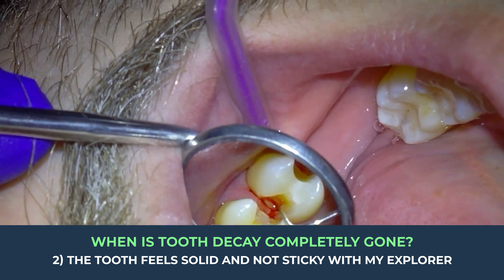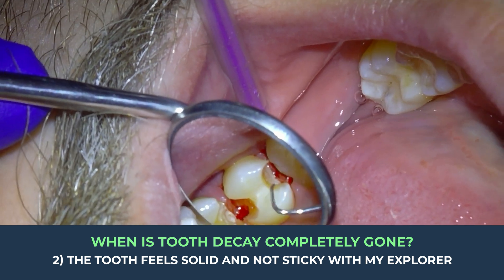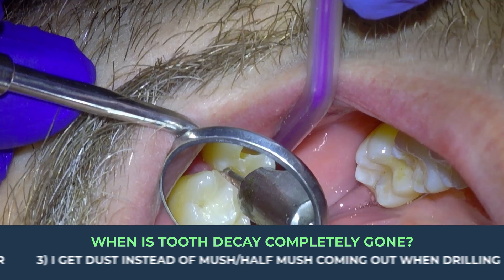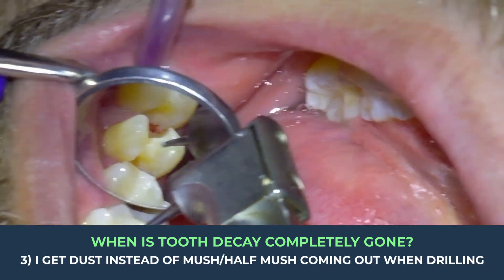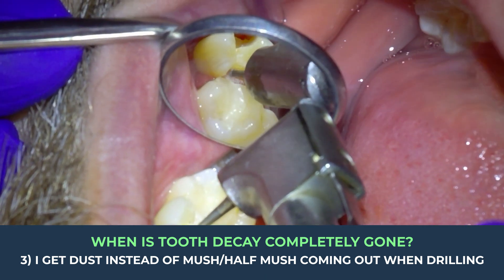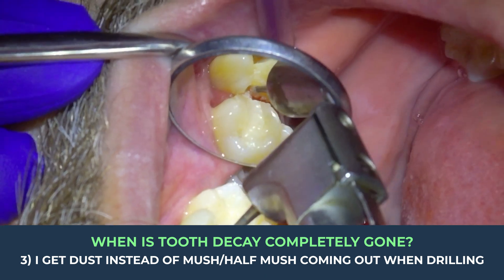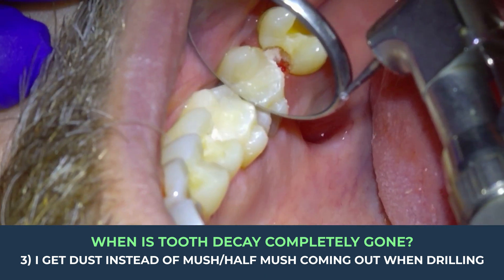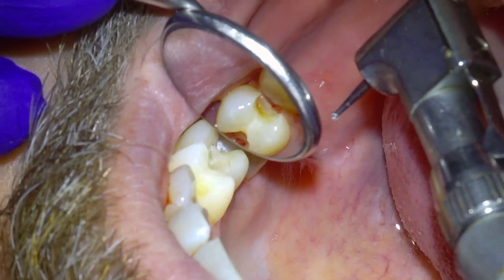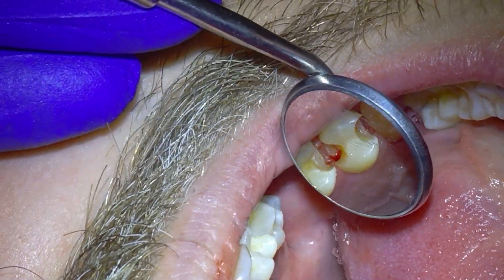When the decay is all gone, the explorer sounds solid — like it's rubbing up against stone. Third, when I use the slow speed drill I get dust instead of mush or half-mush coming out of the tooth. So now I've confirmed with those three criteria that all the decay is gone, we've drilled as little tooth away as needed, and we can place a stable filling on stable tooth.